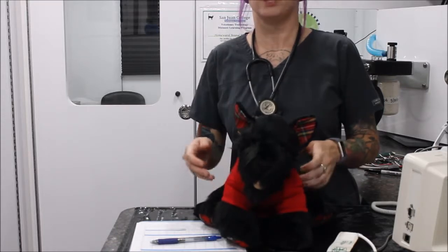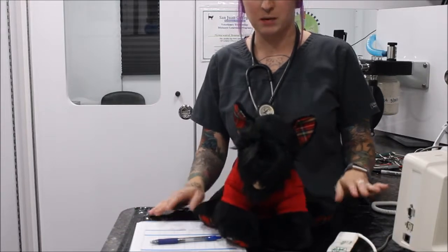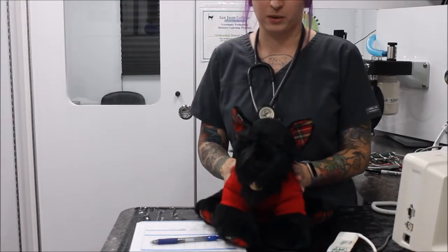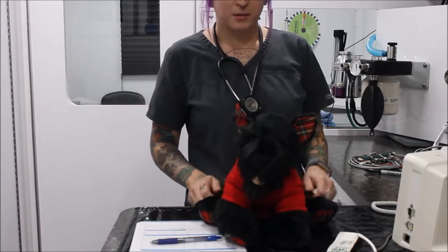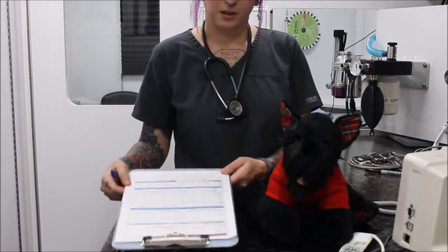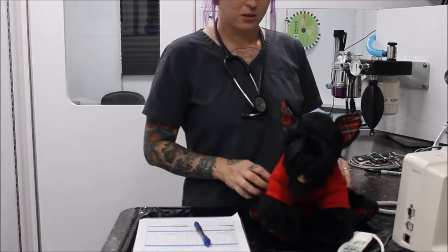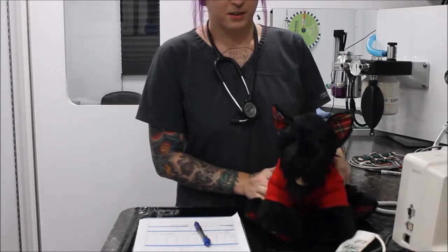And of course if you get jerky motions, that could mean that they're in stage 3 plane 4, which is too deep. You just want them to be nice and regular, and monitor that very frequently. It's important that you monitor both the physiological parameters and the anesthetic depth and plane, because they go hand in hand with each other. All those parameters should be monitored and recorded on your patient's anesthetic monitoring form. And of course, if anything is out of the normal limits, you should alert your doctor so you can start to intervene and correct as you need to. And that is it.